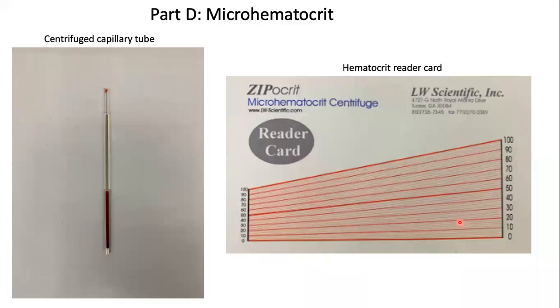Take a look. Super cool. This is the blood sample after it was centrifuged. Here's the packed red blood cells, and then right here is a buffy coat. You can't see it very well, but it looks like this white sort of layer, and that is where the white blood cells and the platelets are. And then you see this golden color. This is actually plasma, and so it should be clear and golden. If it's cloudy and golden, it means you had too many triglycerides in your diet when you last ate.